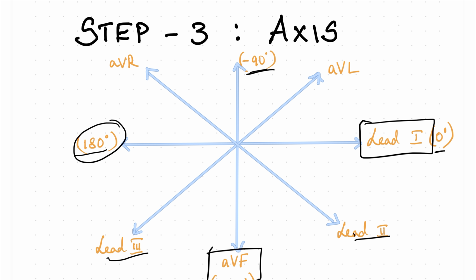Normally when you have studied graphs in school, you've studied that these are positives and these are negatives. But here, there's an interchange between these both. So here what you have is positive and here what you have is negative.